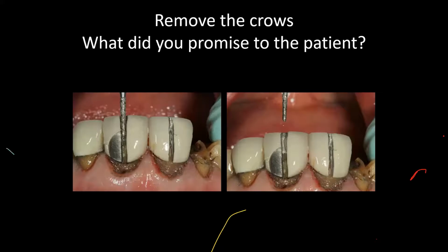Okay, so removing these crowns, and I think today Vivek was with me. He could see how carefully I removed them. There's special techniques, and do not use the hammer. There's other ways of doing it. So think about when you remove a crown, how to preserve the teeth. Because if there was a crack later on under your crown, I can assure you, you caused it, because you did not remove this crown in a very gentle manner.